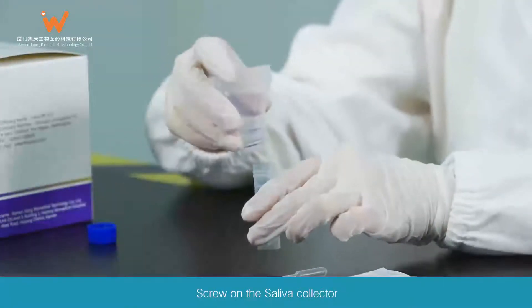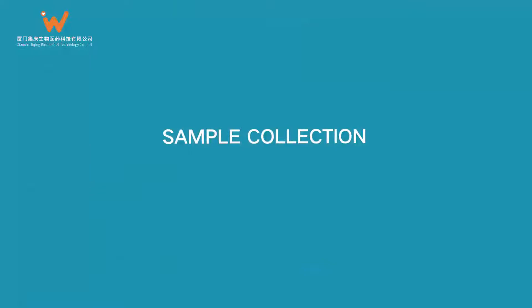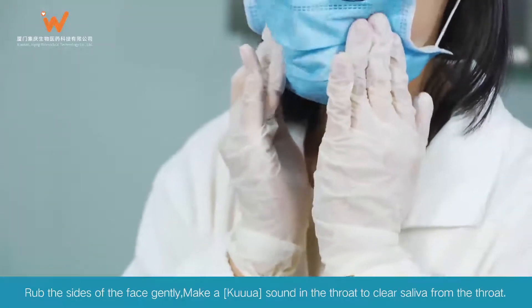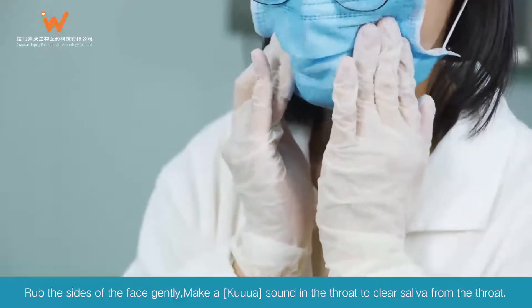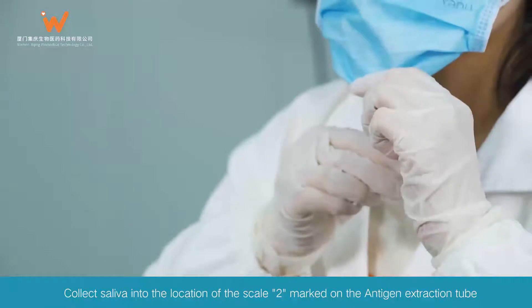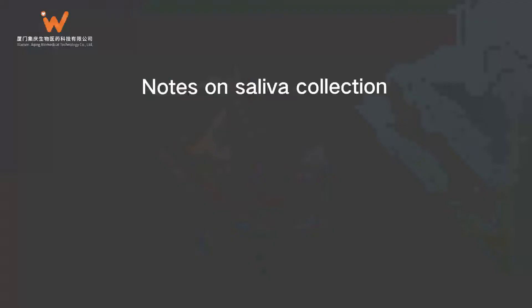Test Procedure: Take out the antigen extraction tube and unscrew the cap. Screw on the saliva collector. Sample Collection: Rub the sides of the face gently and make a sound in the throat to clear saliva. Collect saliva into the location of the scale 2 mark on the antigen extraction tube.